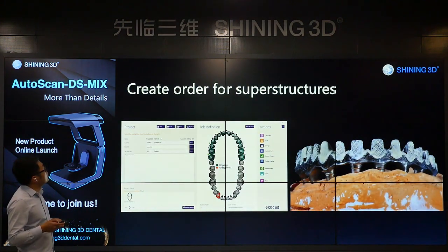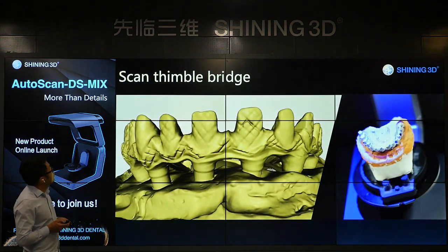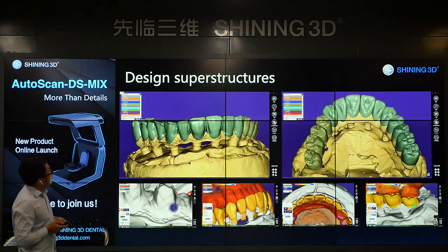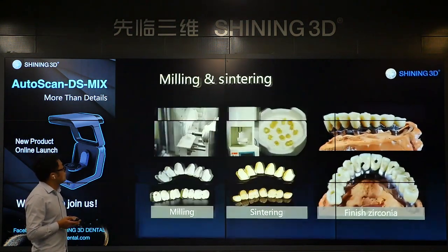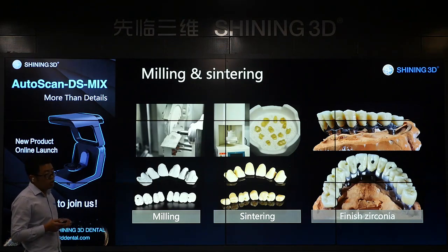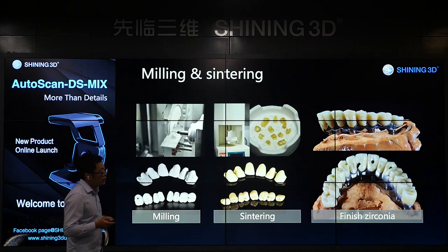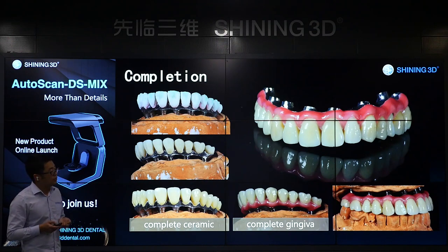So first we need to create order for the superstructures. 17 to 27 crown. So simple bridge scan. Superstructures design. After design, then we need to mill, get the crown, then put in the furnace for sintering. After that, finish the crown. So this is the whole case. Finally, we get the case. It's very beautiful.